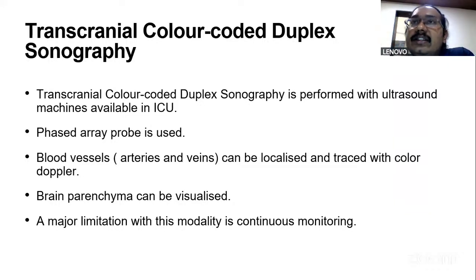So apart from the traditional TCD machine, in case we don't have it in our departments, we can use the routine ultrasound machines, which have a phased array probe. We can use these ultrasound machines with a phased array probe.